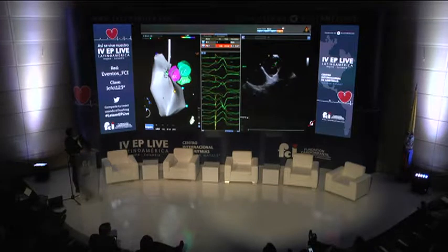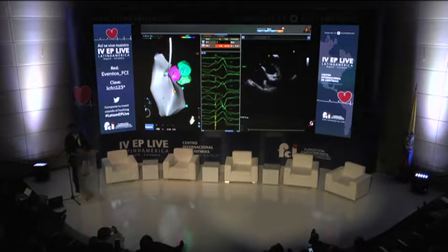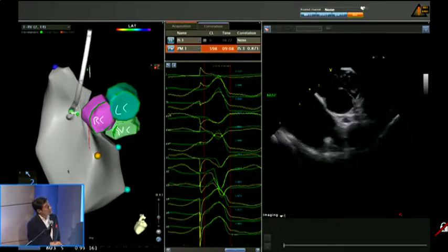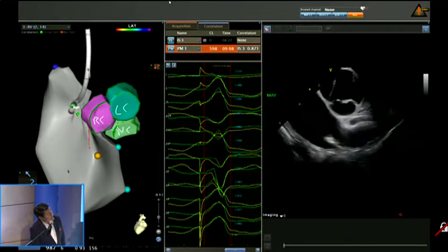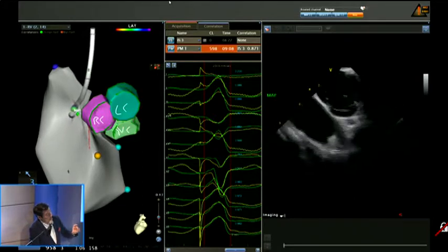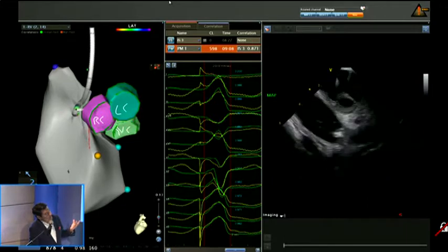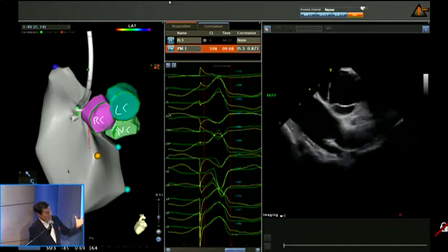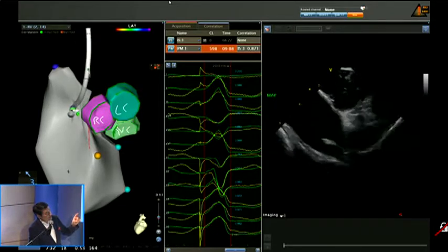Here you can see a green dot, which is intermittent and is consistent with the tip of the catheter. In the upper right side, you see the right coronary cusp, down the left coronary cusp, and you can clearly see the origin of the anterior descending artery. And to the left, you see the non-coronary cusp. At this side, well, let me explain something to complement. Remember that there are two ways to present the image in intracardiac echography.